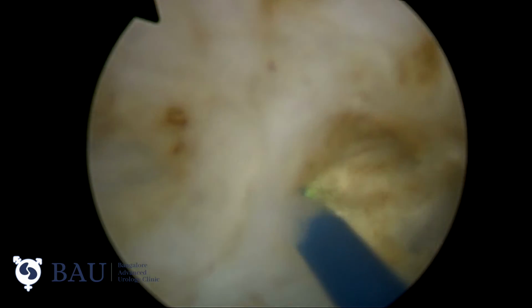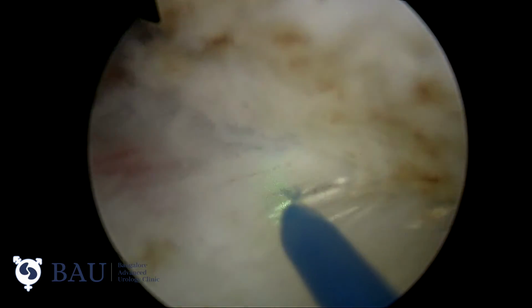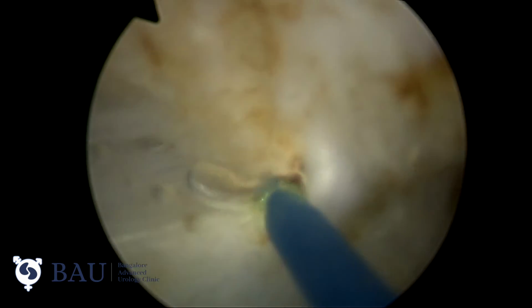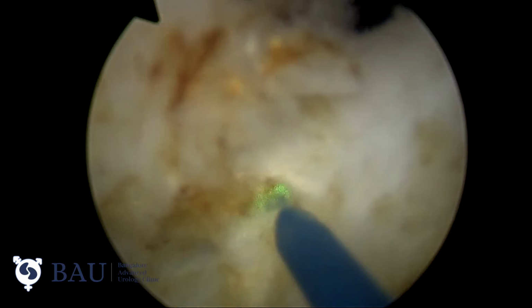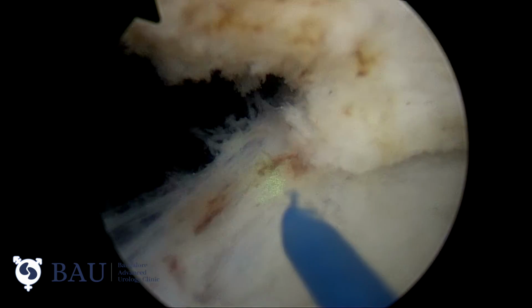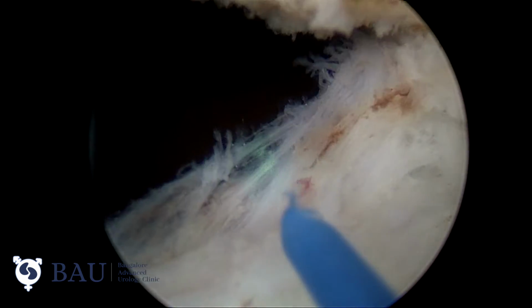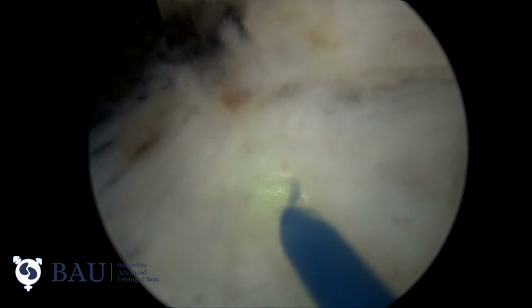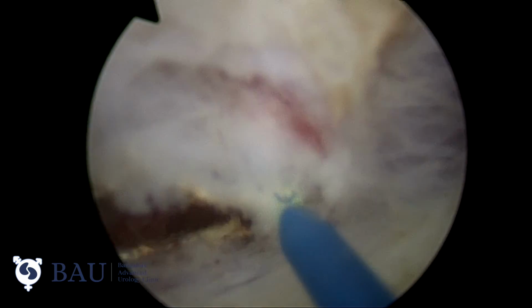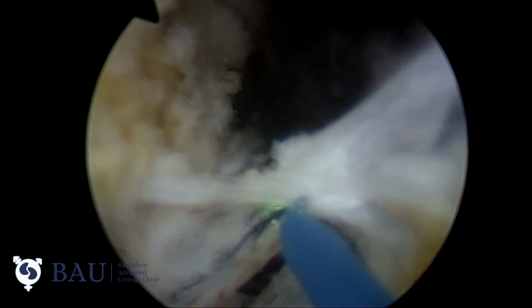Since we have already released the apex, whatever amount of pressure we put on the lobe, it will not affect anything on the sphincter. These are the final fibers of the bladder neck.